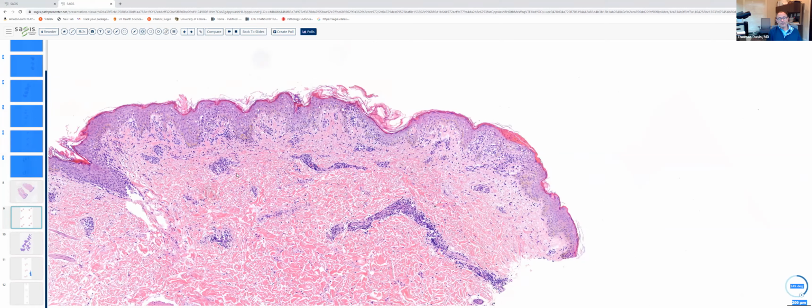With PLEVA, the acute form of the condition, you're more likely to see more spongiosis, ballooning, necrosis, a denser infiltrate, more necrotic keratinocytes along the DEJ, and parakeratosis containing neutrophils. With PLC, similar findings, just a little more blunted.